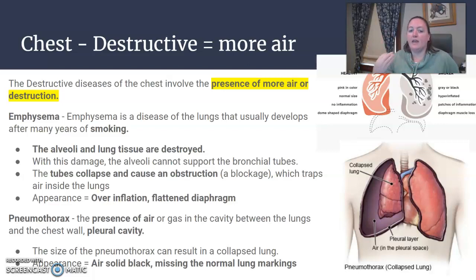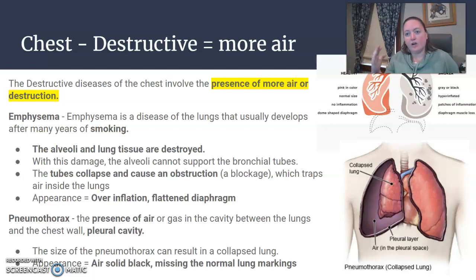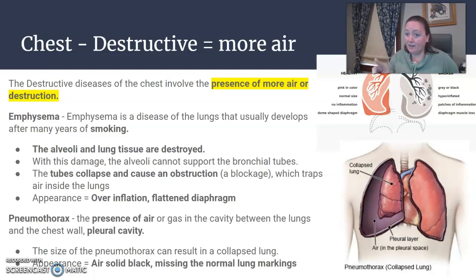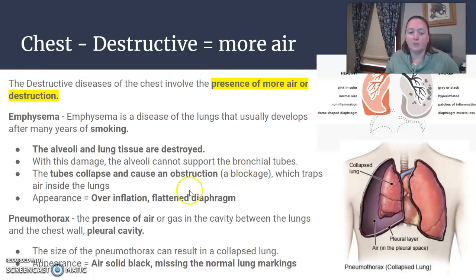Pneumothorax is the presence of air in the pleural cavity. Air in the lungs is normal, but air outside the lungs in the pleural space is bad because, depending on the size of that pneumothorax, it can actually cause the lung to collapse. Pneumothorax is not the collapse of the lung — it is air in the pleural cavity that can cause the lung to collapse, and it will look solid black and you won't be able to see the lung markings well.